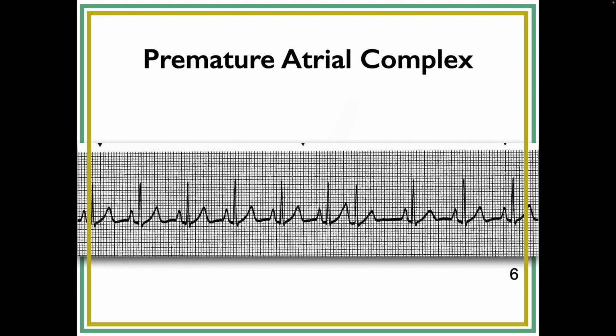Okay, and Spencer? That one? Now, I'll throw it up to everybody. Is there a P wave there or not? I think it's buried in that T wave, because that T wave's a little bit taller than the other. Correct, okay? So you're right, we can't see it as such.